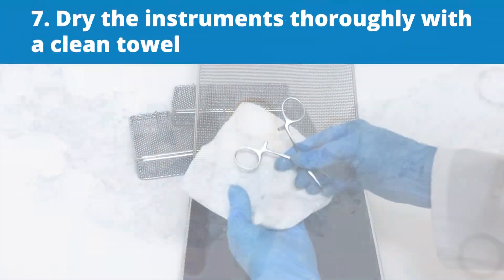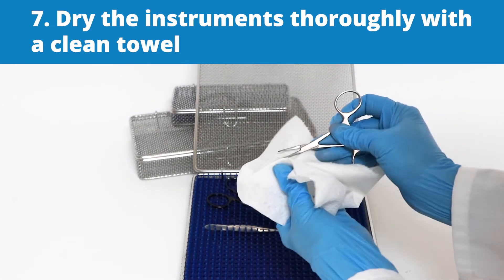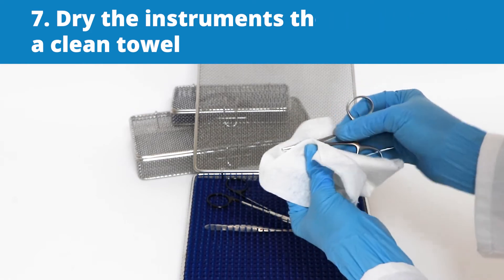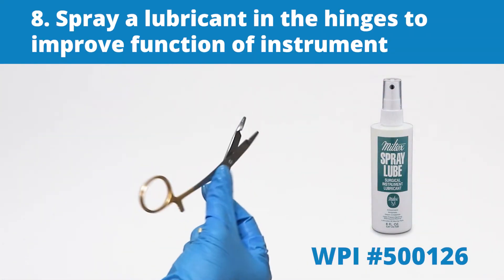Then dry the instruments thoroughly with a clean towel. This minimizes the risk of corrosion and the formation of water spots. Finally, spray a lubricant in the hinges to improve the function of the instrument.